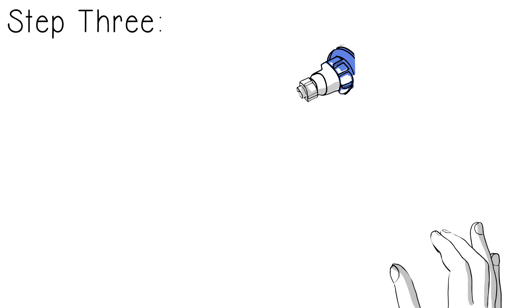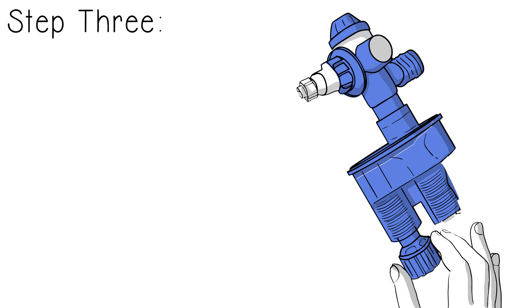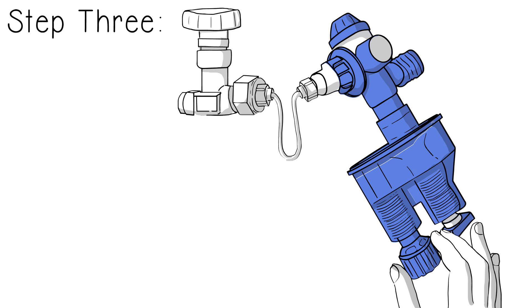Three, adjust exhalation with rate dial. Readjust flow, PIP, rate as needed. That's all it takes to set up on a patient and begin ventilation.